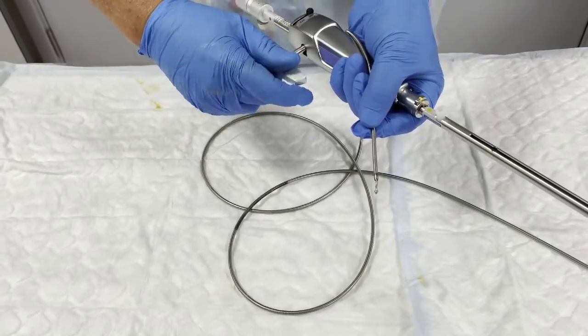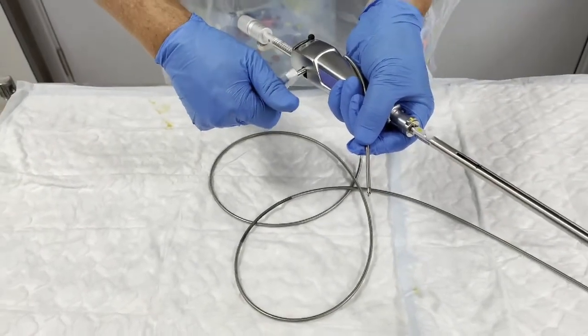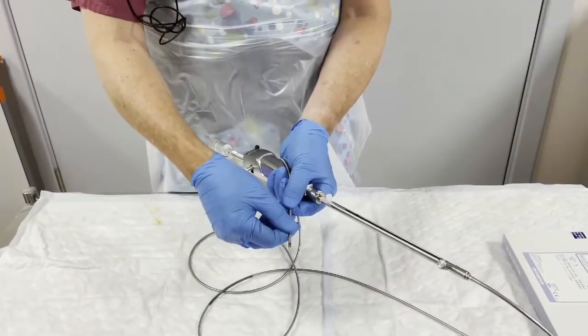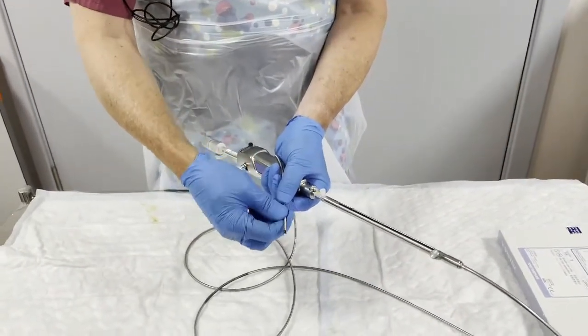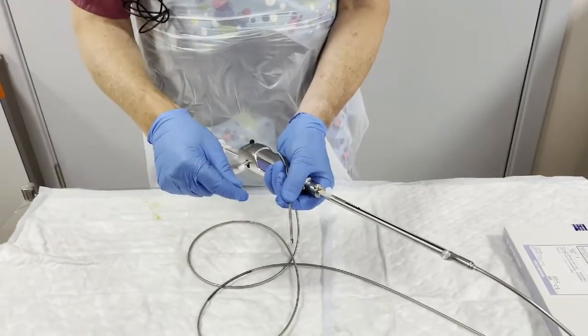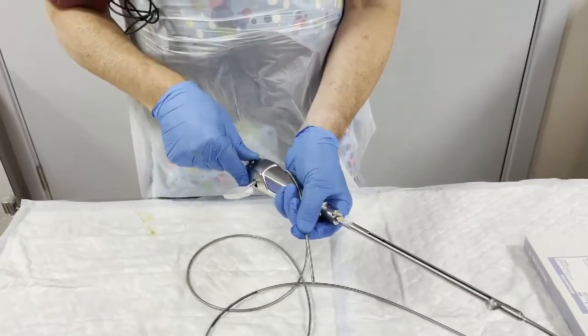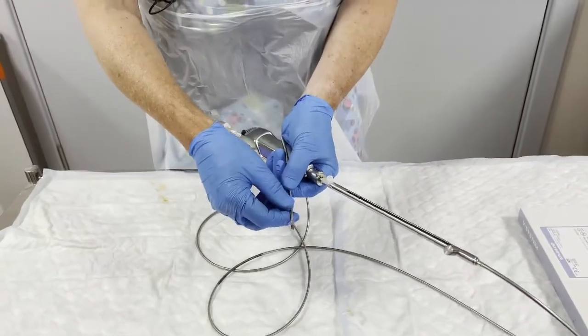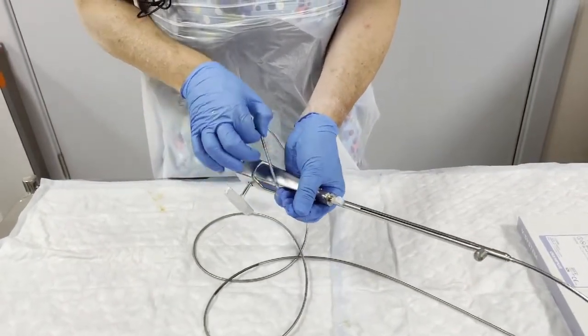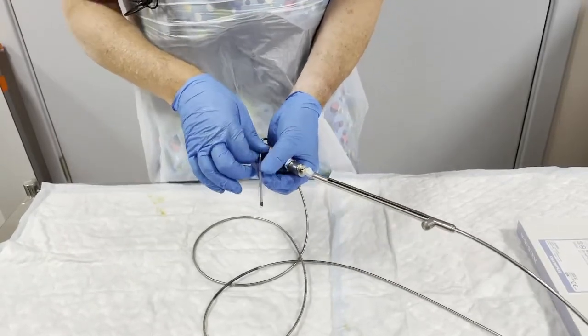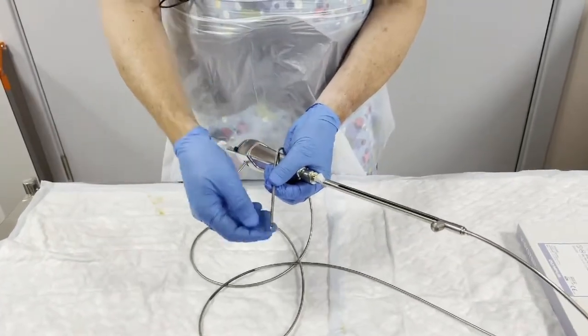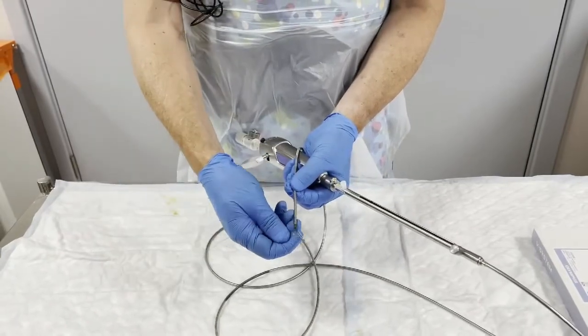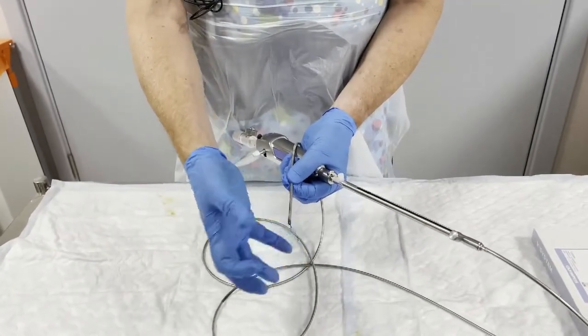When you've crushed the stone, this is then all quite stiff. So if one wants to then take the lithotripsy out of the duct, then we usually release the ratchet, which then takes some of the tension out of the system, and then you can obviously take that out of the duct. Ordinarily, because there will then be within the basket a lot of stone debris that's a bit sticky.